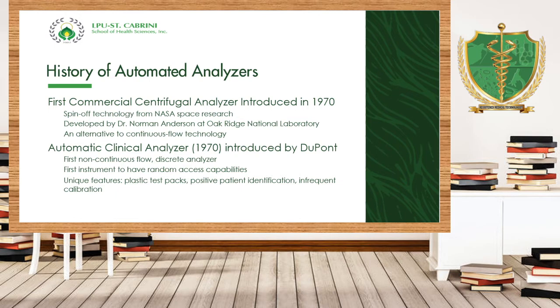Next we have the automatic clinical analyzer, which was introduced in the year 1970 by DuPont. Take note, guys, that DuPont is now known as Siemens. Since we had the problem of continuous tubing and carryover, the automatic clinical analyzer was able to introduce something that will help us eliminate the possibility of having a carryover. Thus, they introduced what we call the non-continuous flow.